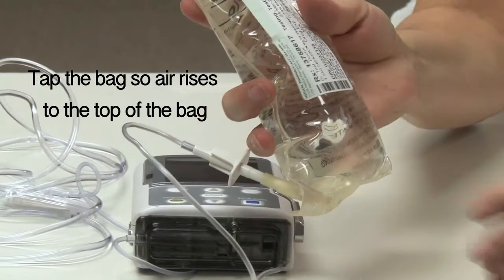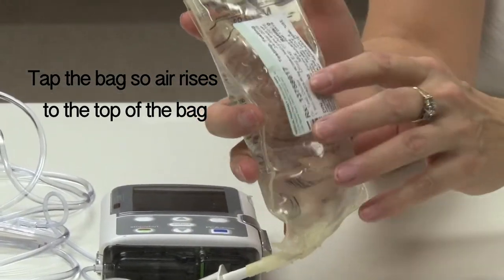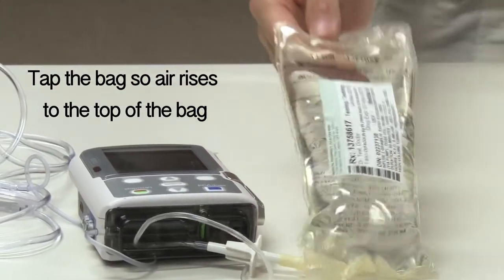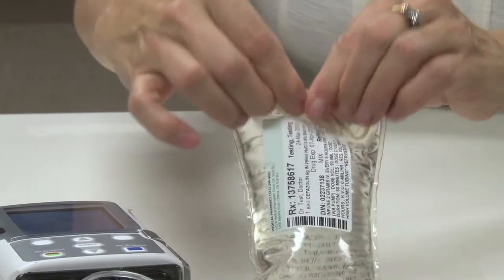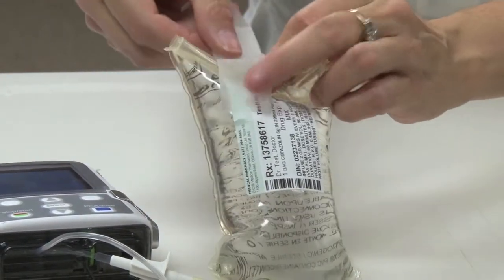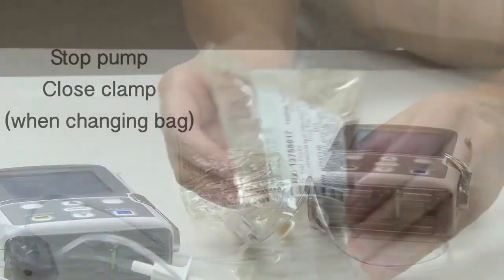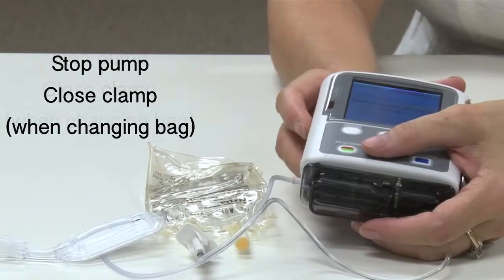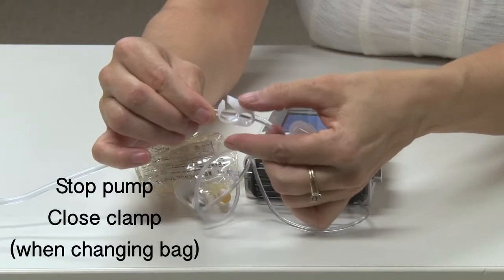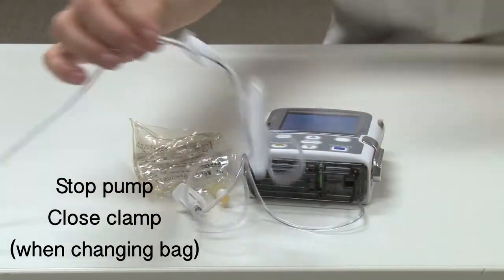Consider suggesting to the patient to tap the bag at night when going to bed and positioning the bag upright to keep air bubbles at the top of the bag. Some patients have found it effective to roll the empty portion of the bag so that if there is any air, it remains in that empty portion rather than the fluid. When the reservoir is empty, stop the pump before replacing a fluid container. Close the clamp prior to removing the IV bag from the tubing to prevent introducing air into the line.